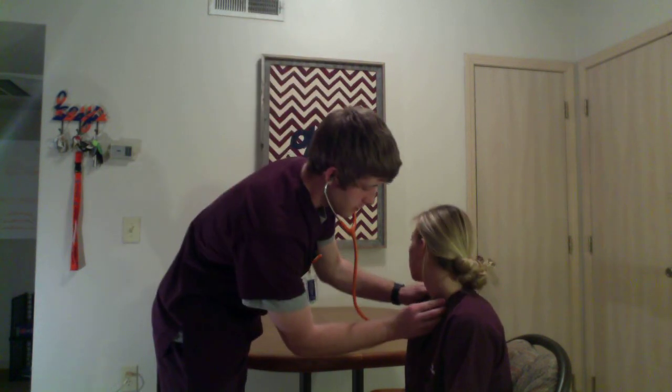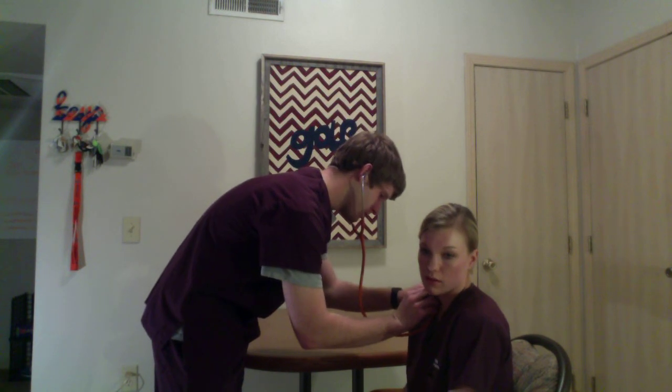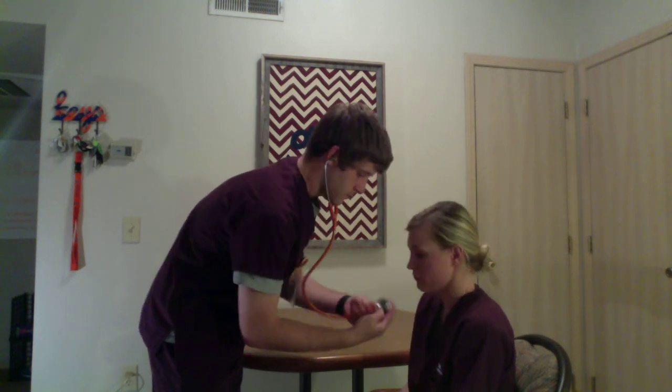I'm going to start with the bell here. If you will, turn your head. Deep breath. Other side. Okay.